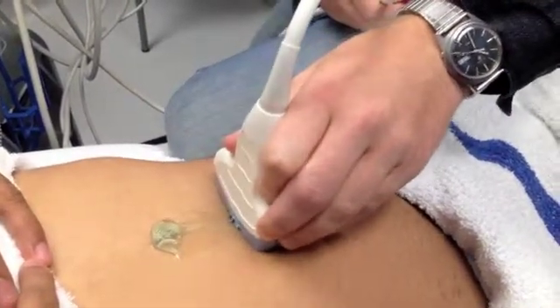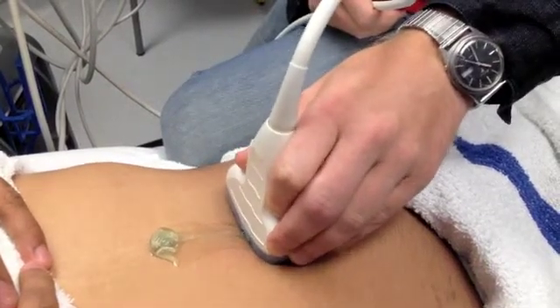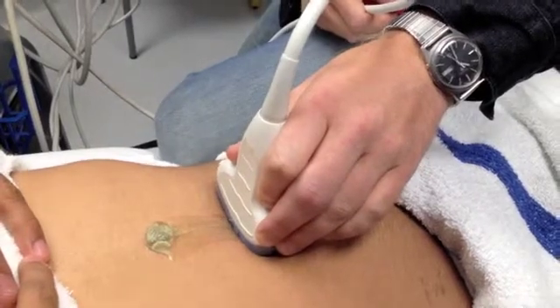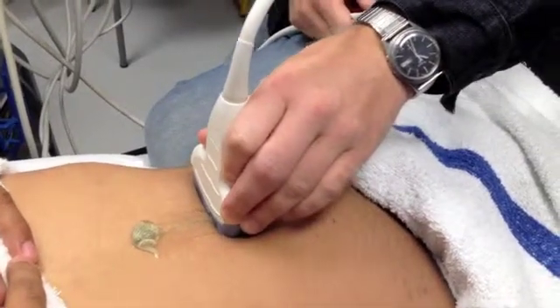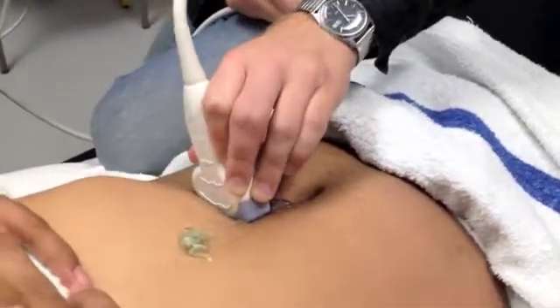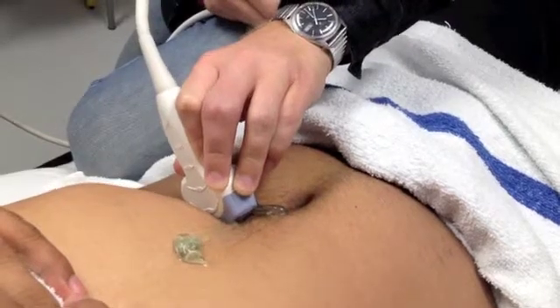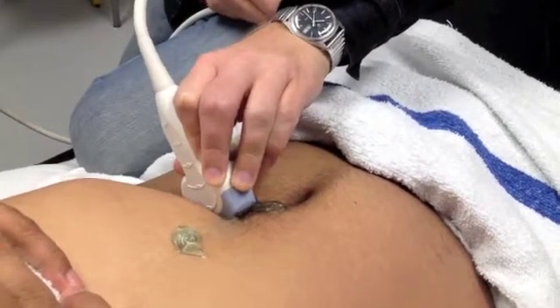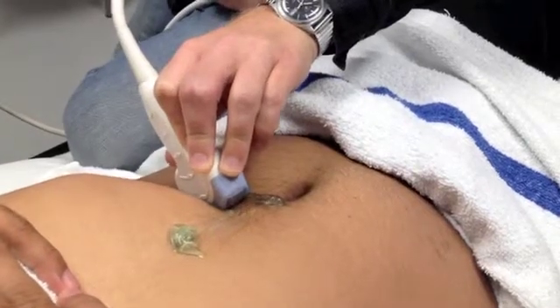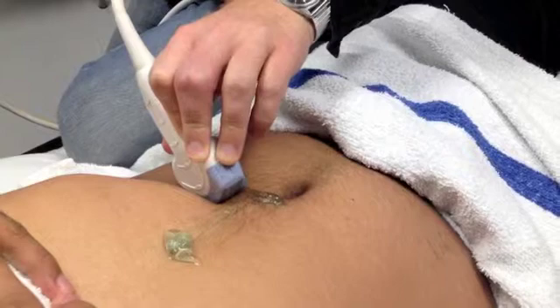Sometimes there'll be a pocket of gas that you can't deal with by compression. An effective technique is to try and move laterally, and then rock the probe or angle the probe back towards the midline, keeping the aorta in view the entire time. This is particularly useful for getting around gas at the umbilicus, or if the patient has a piercing at the navel.